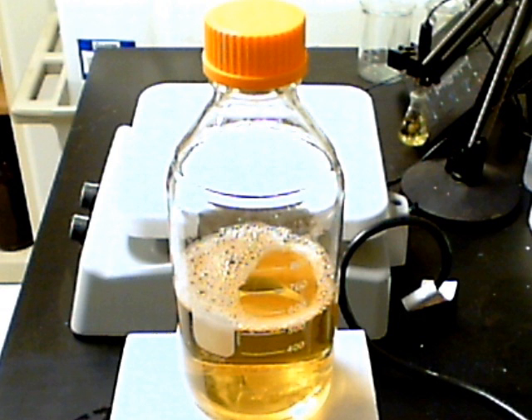Carefully pour the liquid into a container that is safe for autoclaving, such as shown in the example. Autoclaving is necessary to kill any microorganisms, such as bacteria or fungi, that may have contaminated the solution. Sterile or aseptic conditions are an absolute requirement when using microbiological techniques. This solution is now ready to be autoclaved, and can then be poured into petri dishes or culture tubes to be used in our study.